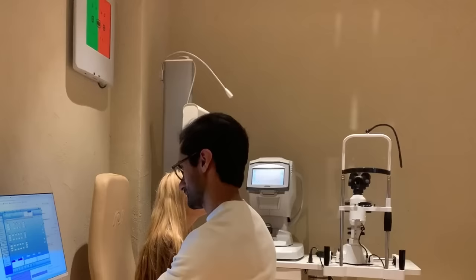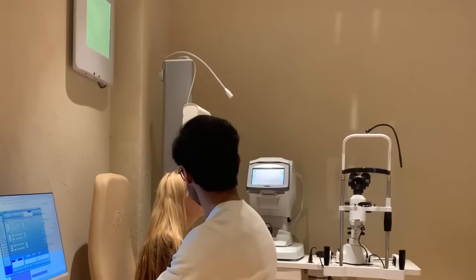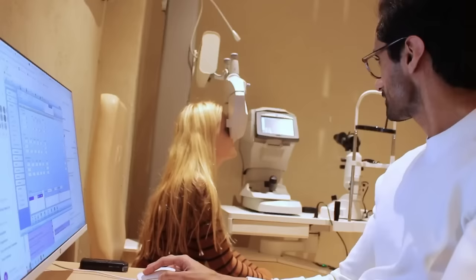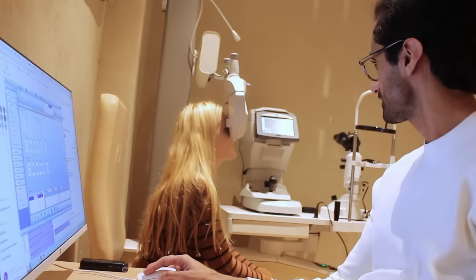Just onto red and green then. Are the numbers better on the red side or better on the green side? Red side. No? Possibly the same. Quite close. You go for the last line. It's pretty small. E? Yeah. P-H. Okay. I'm going to show you no glasses. Yeah, I haven't read any of them. That's with the prescription in. So much better. Much better.